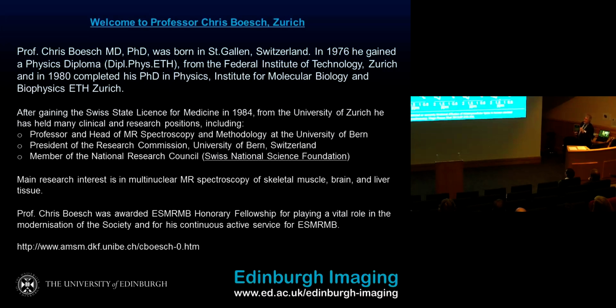To measure the droplet size and the effect of diet, of physical activity, and of pathology on the droplet size would require more gradients, stronger gradients. We were very happy that we had announced that we would get a Prisma about 3 years ago, but because of the building problems which we had in Bern, we were waiting until last year that we got the Prisma.